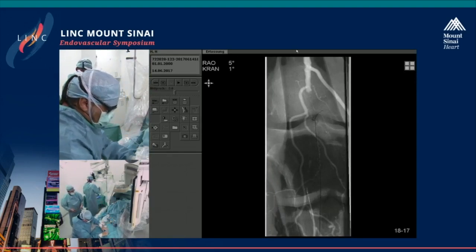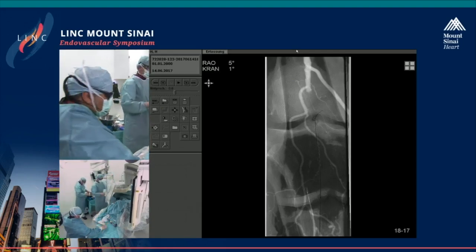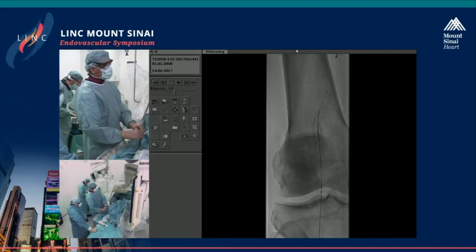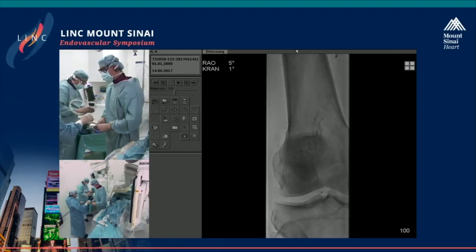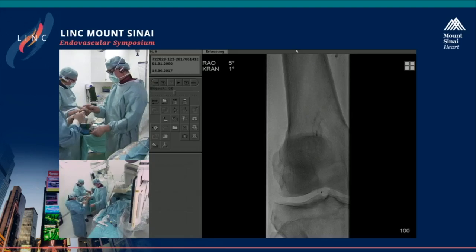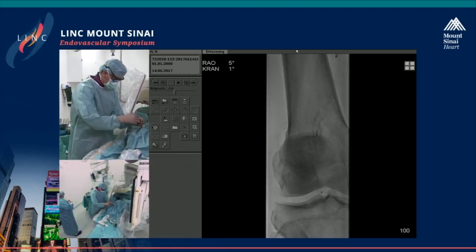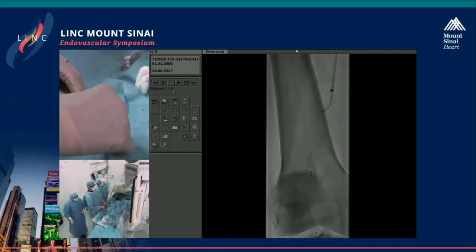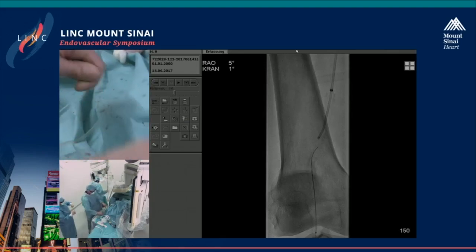So now we take a Judkins right catheter here into the sheath from retrograde to snare out the wire. Sven, if you could hold the catheter here. And from this side, it's better here to take a new wire, because this is relatively destroyed at the tip. Was not completely soft, wasn't it? I mean, can repair. Yeah, according to the wire tip, which is left, I think this lesion was also a little calcific, maybe. Okay, so Sven is taking the catheter a little further down. We may need here a torquer to do this. Just a moment.